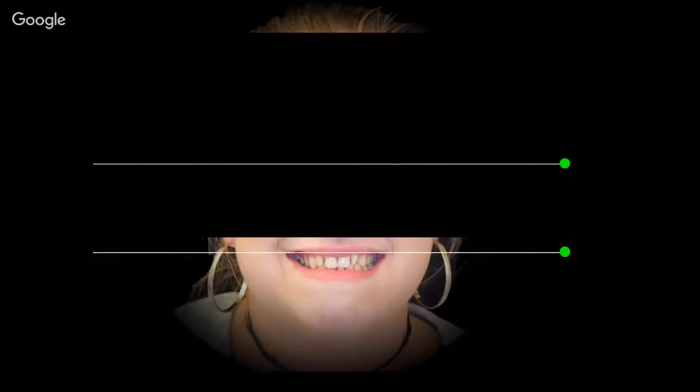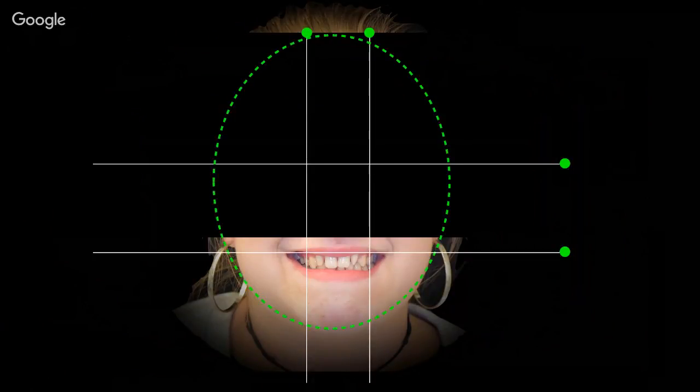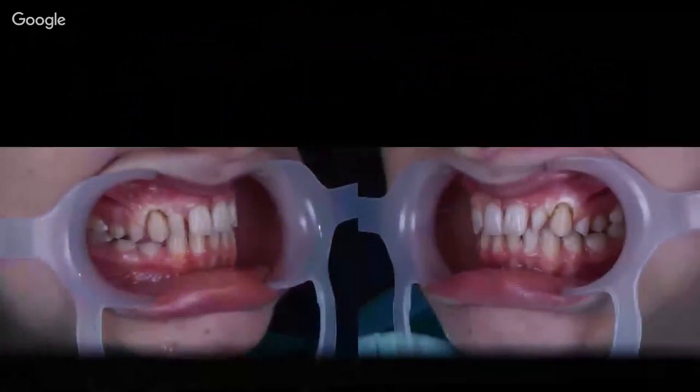So first of all, as usual, let's make some smile analysis, and let's check the teeth proportion. And we can see that they are pretty good, not so bad as proportion. So let's make our treatment plan. And then I made gingivoplasty as well with gingivectomy with laser, because there was too much soft tissue.